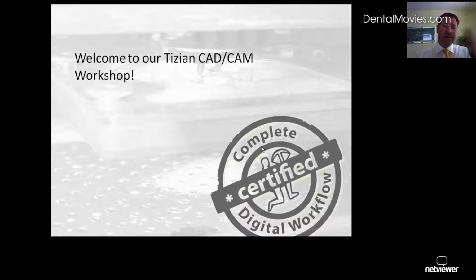So let's start with our first presentation for today. Later on at 3 o'clock German time, we will have the same presentation once again. So if you want to invite a friend or see the presentation again, you are welcome to see us at 3 o'clock again. I will work together with my colleague Jochen Sagolla. He is one of our technical advisors, and he will run the software later on and present a live case presentation to scan and to modulate on an implant abutment. So we will try to show you step by step how everything works.